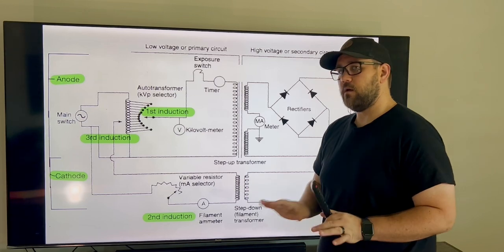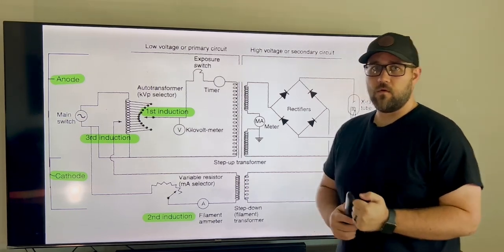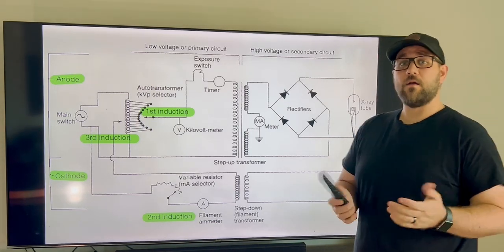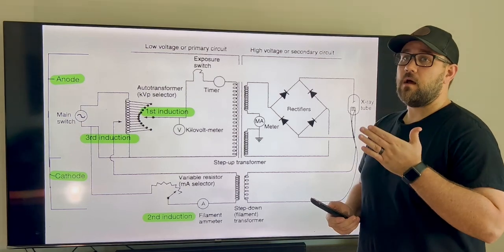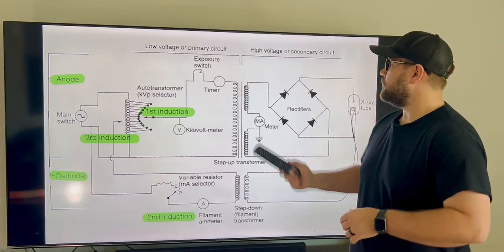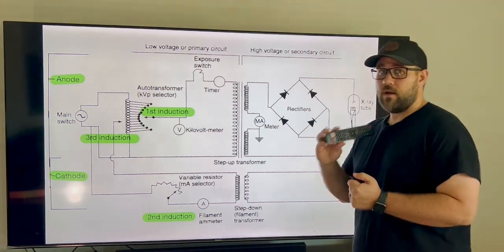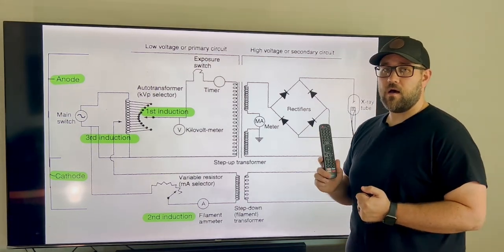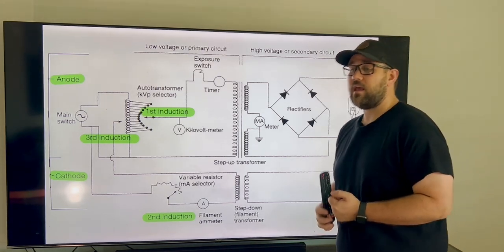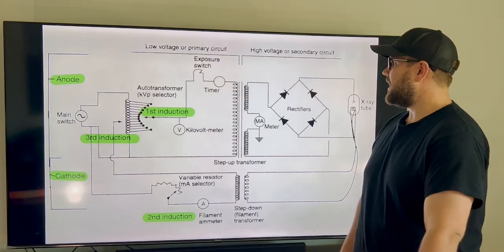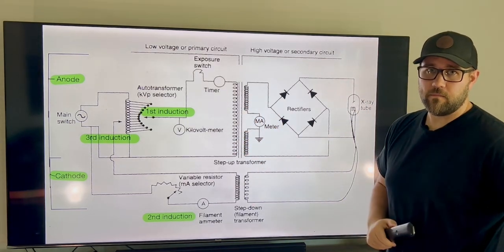So I do want to hold up here and talk about something that's really important, because if we do not hold the switch for the whole time, we're going to have some errors happen and possibly potentially lessen the life of our machine. So if we do not hold that exposure switch for the whole time that our technique will set, and we don't wait for the visual and audio cues to finish, we potentially can wear our machine a little bit faster. So just heads up on that, hold the switch, let the machine function properly, and then go from there.